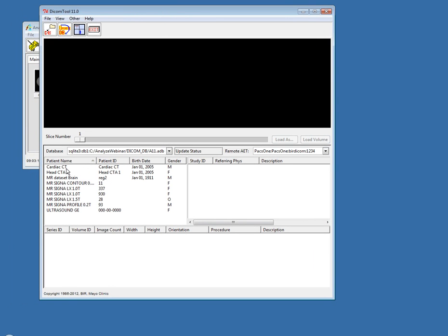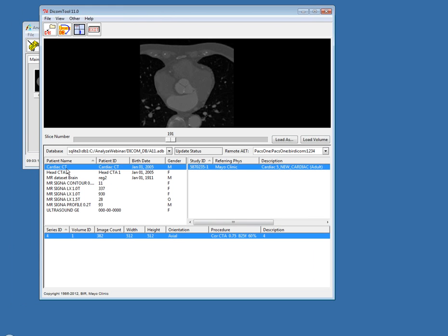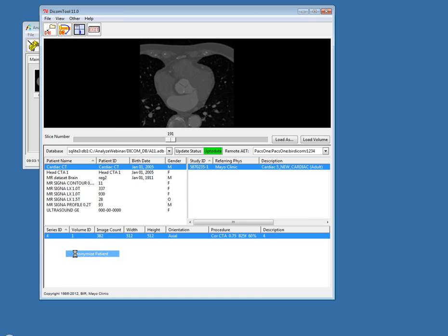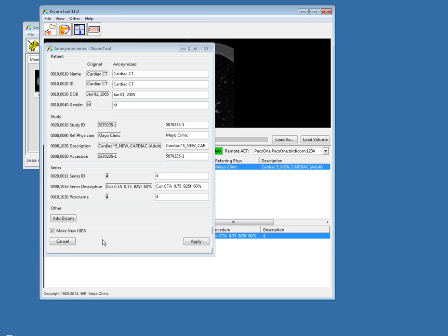Previously, you were only able to anonymize patient information. In Analyze 11.0, you'll now find that you can also anonymize study and series information. If I right-click on a data set and choose Anonymize Patient, you can see that I also get these study panes as well as series, so we can edit all of that information as well.